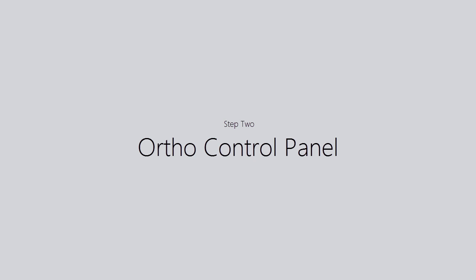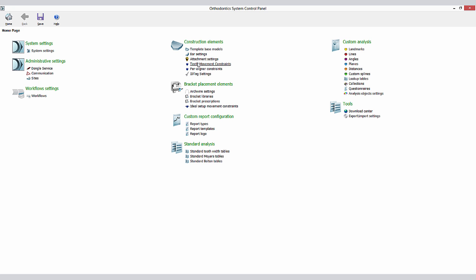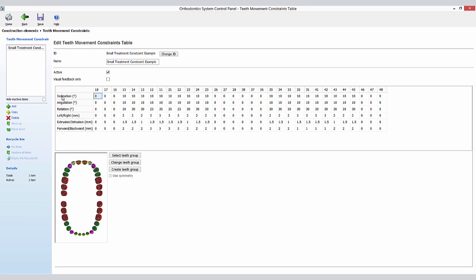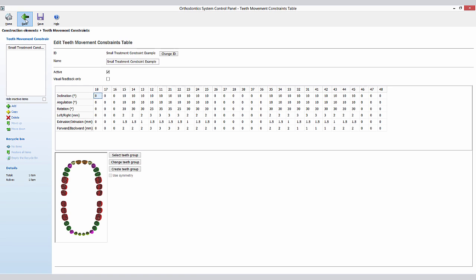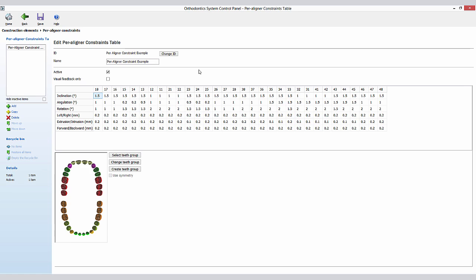Now let's have a closer look at the ortho control panel. I will explain the functionality of the new features. You can now define constraints per tooth in regards of inclination, angulation, rotation, left and right movement, extrusion, and forward and backward movements. These movements can then be fine-tuned by defining their constraints per aligner.